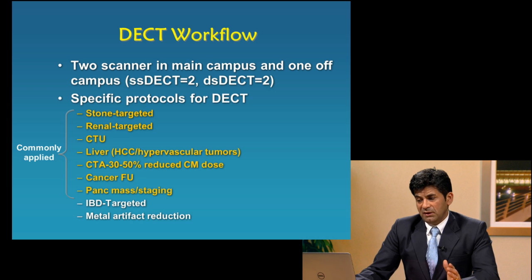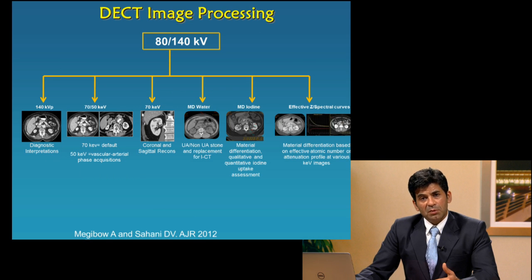And we get dual energy application any time patients come with these indications. The processing is performed by the technologist on the scanner console, and these images are available on PACS. To minimize the number of images, we create monochromatic images and material density pairs based on the clinical indications. So arterial phase acquisition will have low keV monochromatic images, whereas portal venous phase will have intermediate keV monochromatic images, and every patient gets a material density pair.